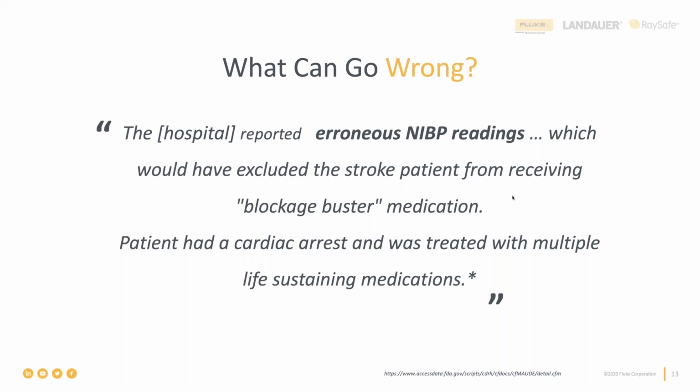at the time a stroke patient, did not receive a blockage buster medication, and as a result of that had a cardiac arrest. Luckily for the patient, they were then treated with proper medications, but simply imagine this horrific situation. And this situation is an example of exactly what we must prevent by thoroughly testing patient monitors.